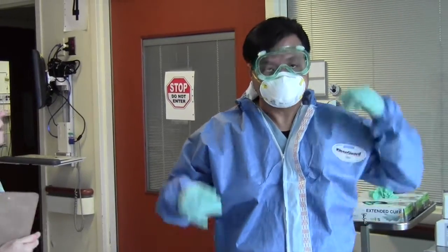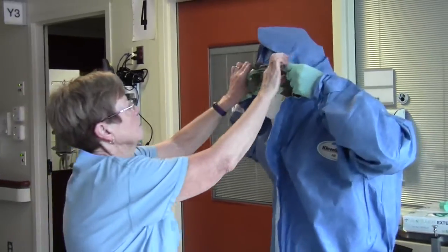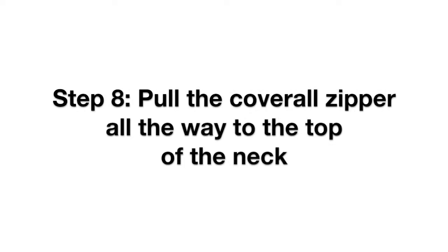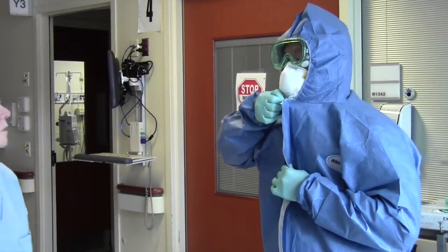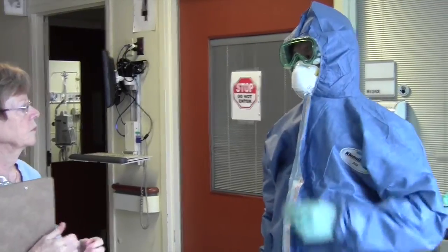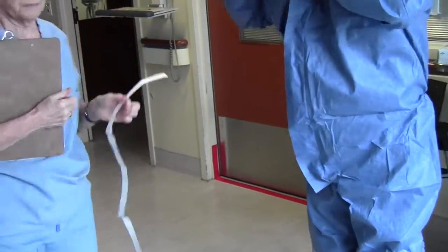Step 7. Pull the coverall hood over your head. Step 8. Pull the coverall zipper all the way to the top of the neck. Step 9. Pull away the adhesive strip from the zipper cover and press down to cover the zipper.